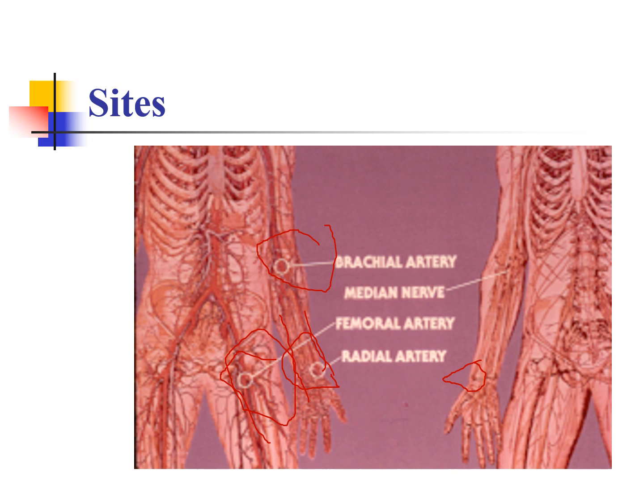So when you feel for the femoral artery, this is something they might have their hands on while they're doing chest compressions, to feel how strong the compressions are, how effective the compressions are. But this would be a site that you only usually access during a code situation. Some hospitals don't let RTs even draw from the femoral site. Usually this is a 90-degree stick with a large bore needle.